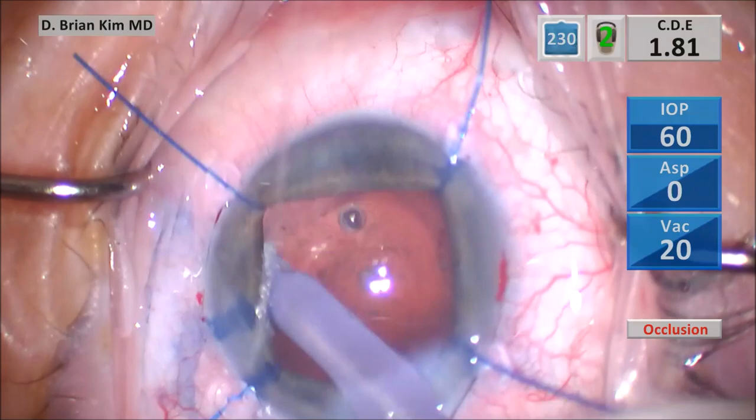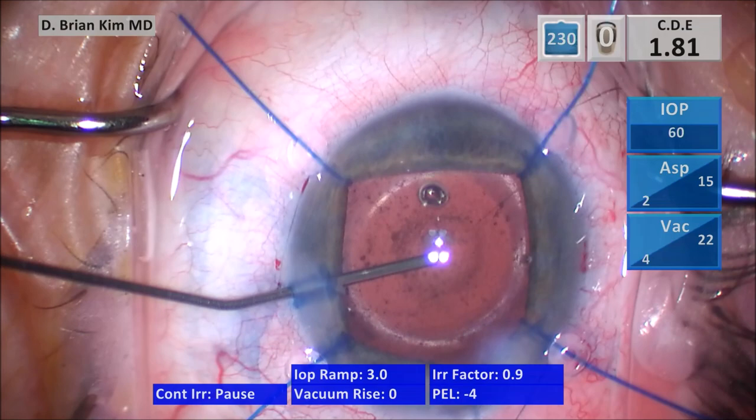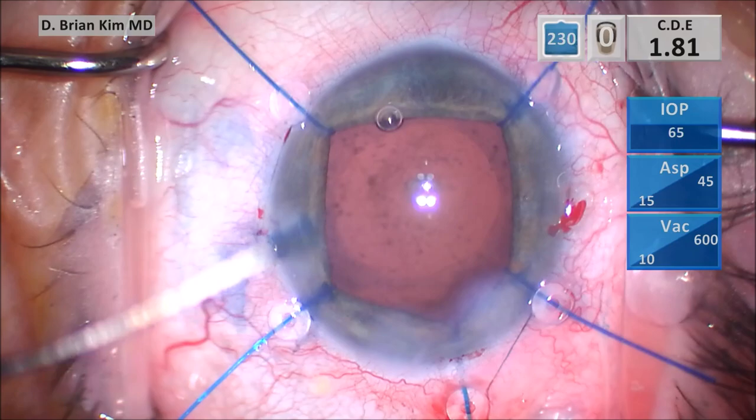I pulse some BSS into the sub-incisional capsular fornix — it was fairly clean. I inject cohesive viscoelastic into the bag, then start to sweep underneath the anterior capsular rim, starting on the left side and then switching to the right. The bag is fairly clean, but has quite a bit of adherent fibrosis, so I don't perseverate trying to go after that in this context.